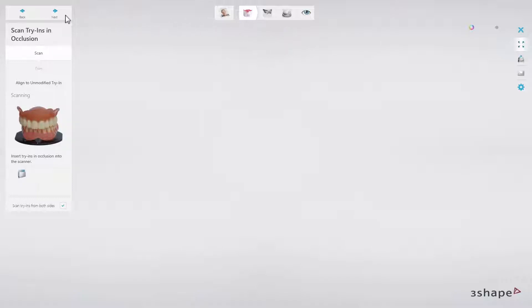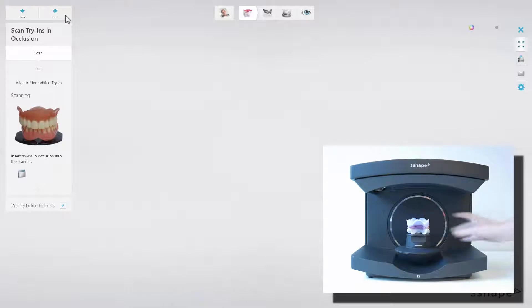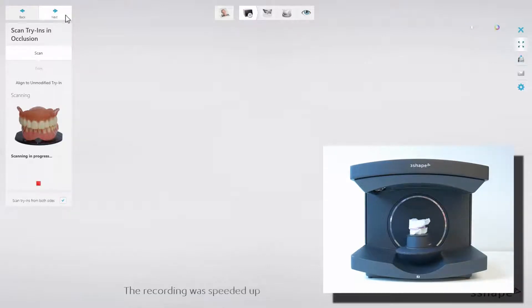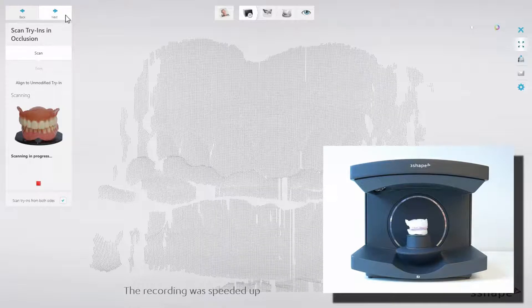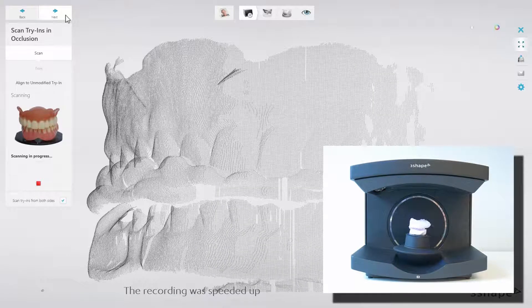Start by fixing both try-ins in occlusion on the scanning plate using BluTac. Then insert the plate into the scanner. For scanners with the auto scan option, the procedure starts automatically.